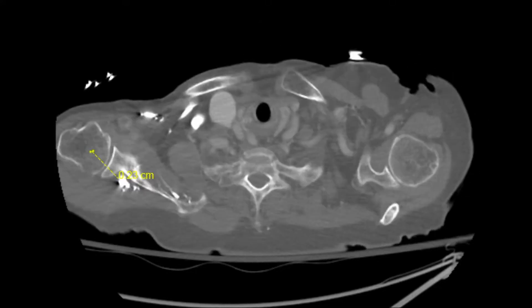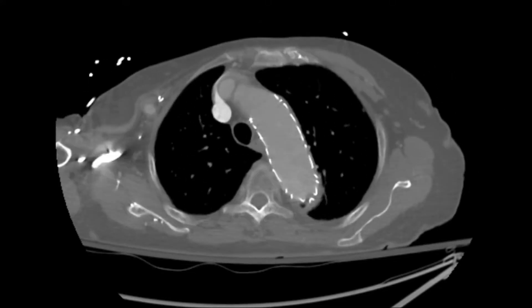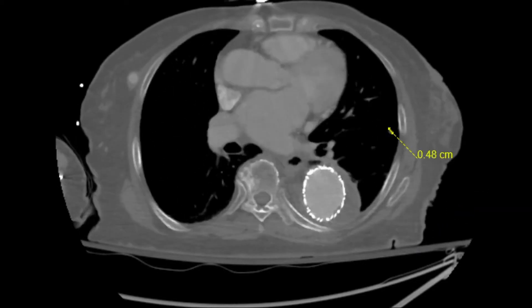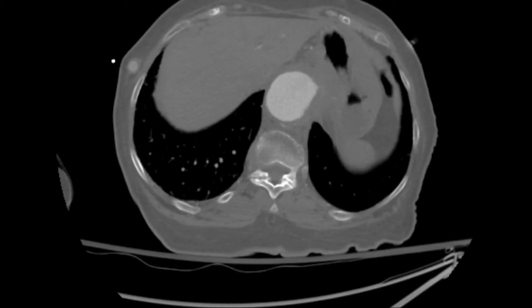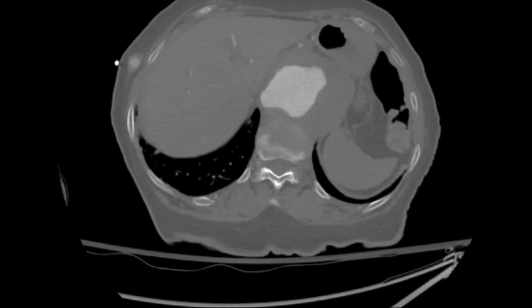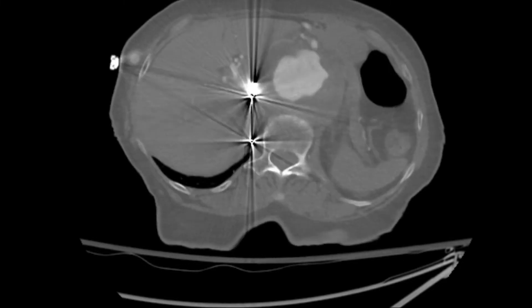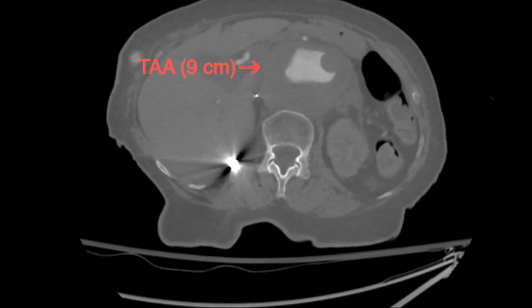This is her CT scan from 4 years prior that demonstrates an endovascular repair of her descending thoracic aorta for aneurysmal disease. It also demonstrates a 9 cm thoracoabdominal aortic aneurysm that extends just distal to her prior aortic repair to the visceral aortic segment, as shown on this CT scan.